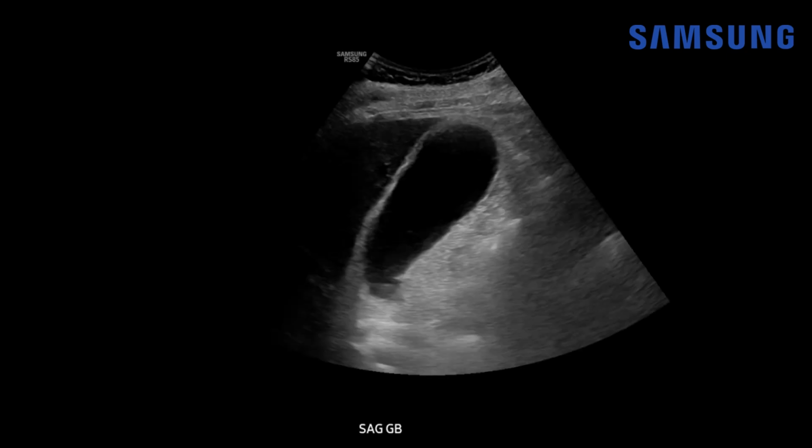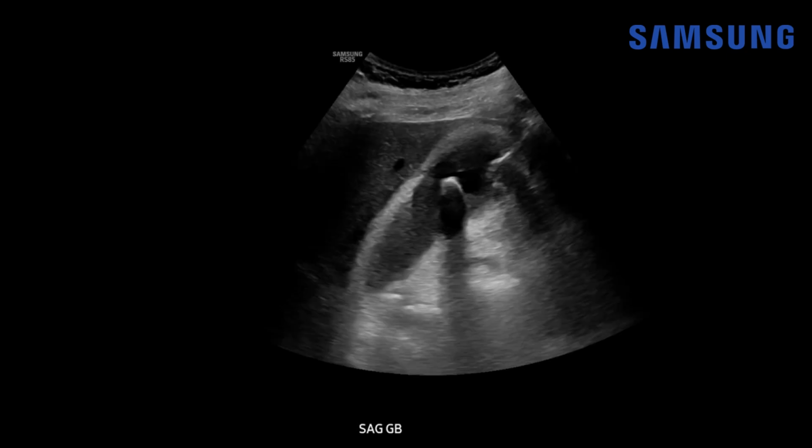So here we're seeing on this sagittal view a distended gallbladder, and we're seeing some mild wall thickening. On this image, we don't see any gallstones, but as we continue to scan, we see an echogenic gallstone here with post-acoustic shadowing, as well as some sludge, and we're starting to see more wall thickening and additional stones.